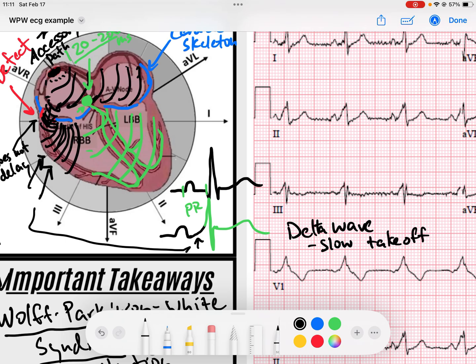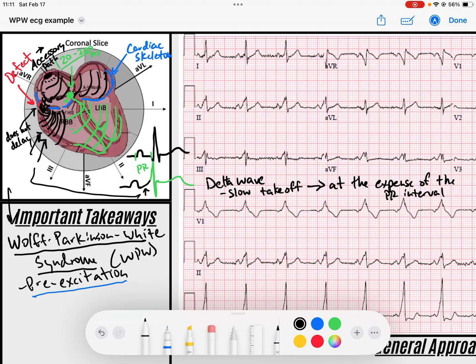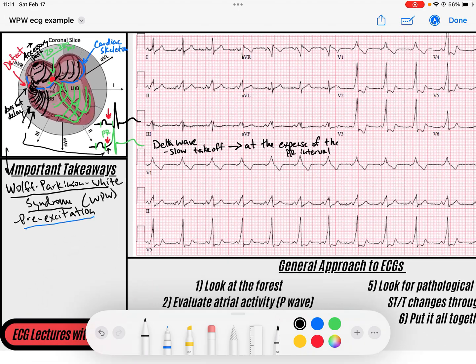The delta wave is a slow, non-sharp takeoff because conduction is going cell to cell via gap junctions, not the His-Purkinje system. That delta wave and slurring takeoff occurs at the expense of the PR interval. The PR interval represents the period of AV nodal slowing — and while we should be in that period, pre-excitation is already occurring in the ventricles. So the PR interval in these patients will shorten, typically to less than 120 milliseconds, which is the lower limit of normal.